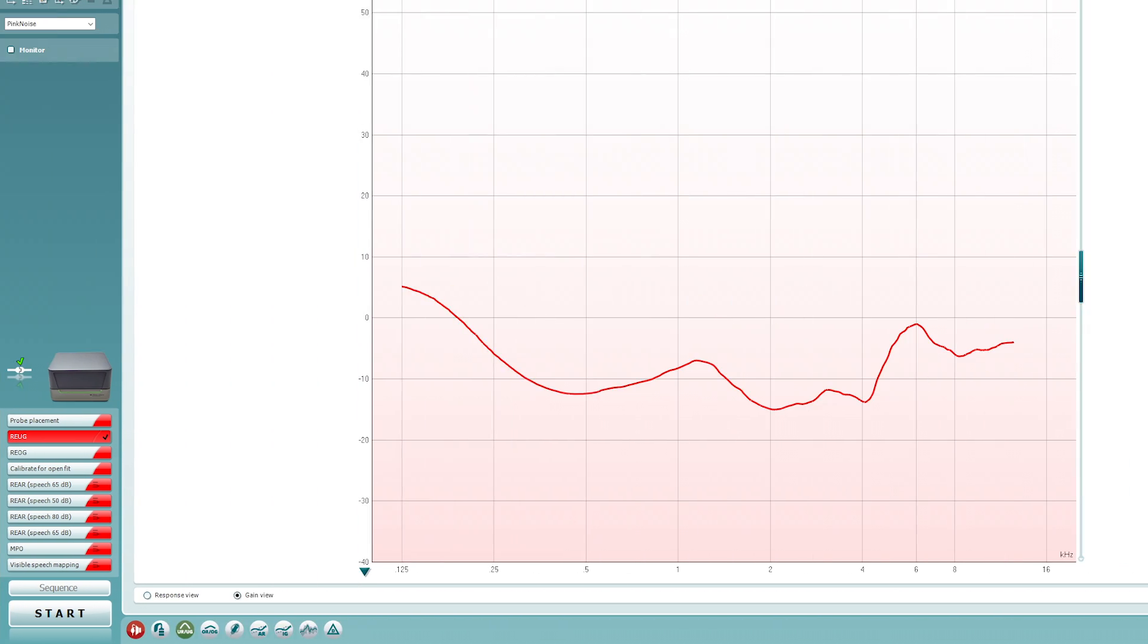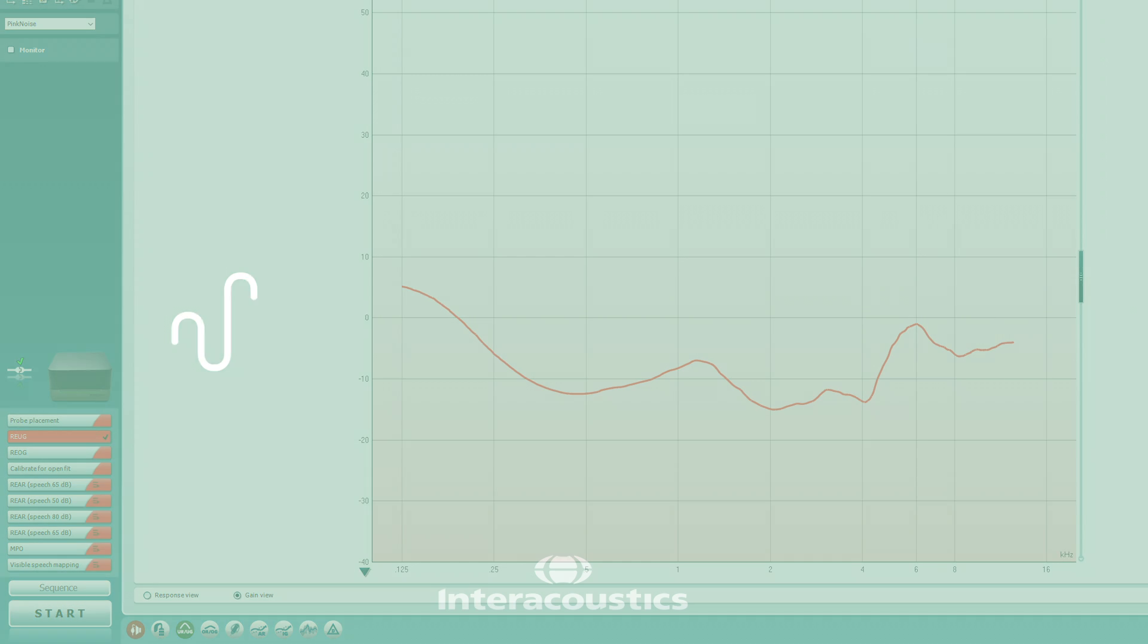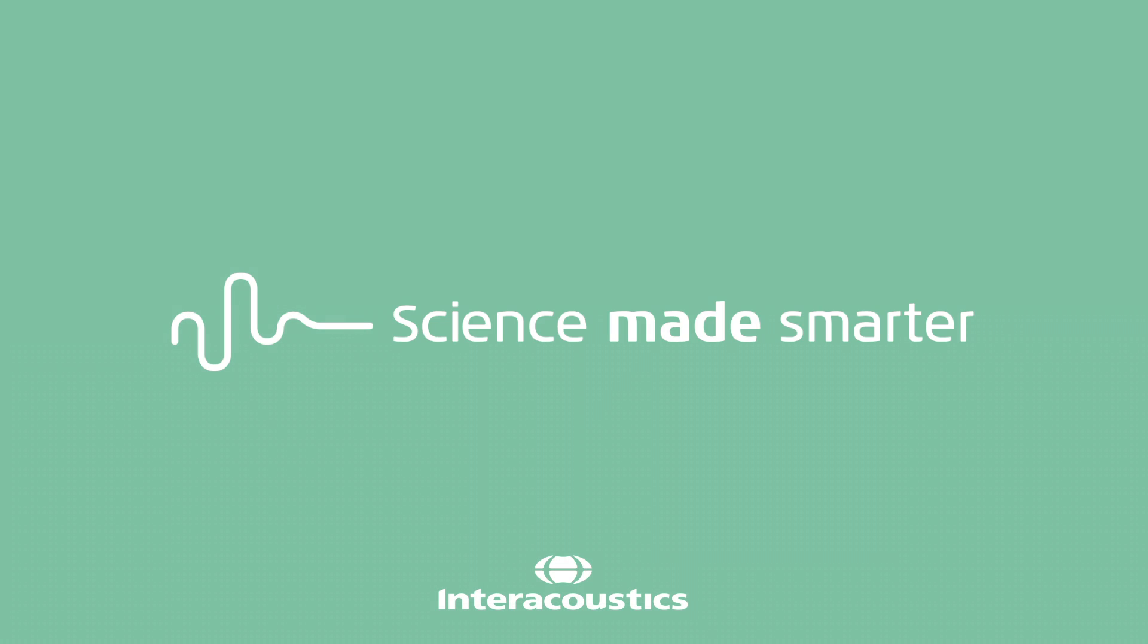If the probe tube is blocked or inserted incorrectly, the REUG curve will look obscure and be dominated by negative values.